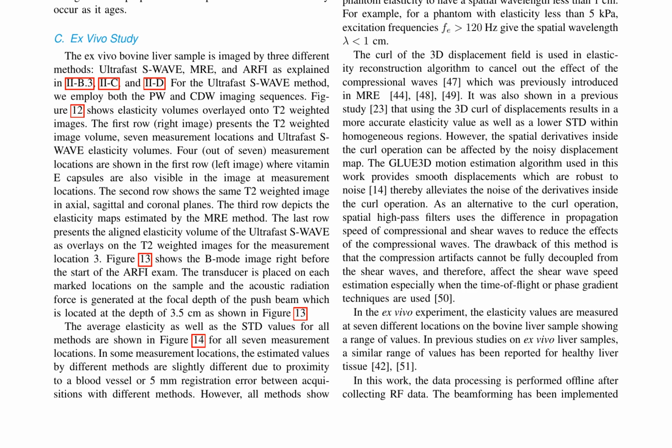methods. The discussion highlights the benefits of employing a novel real-time volumetric data acquisition based on the SWAVE technique, which measures 3D displacement fields over a volume and enhances the accuracy of estimated elasticity values. To fully utilize the potential of the proposed method, it is recommended to have at least one full spatial wavelength of the shear waves in axial, lateral, and elevational directions.